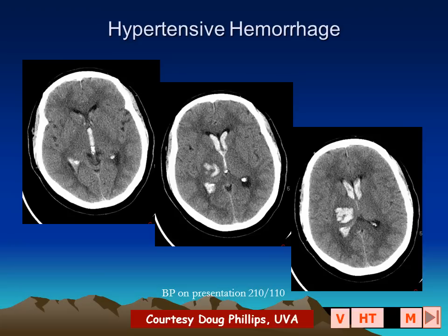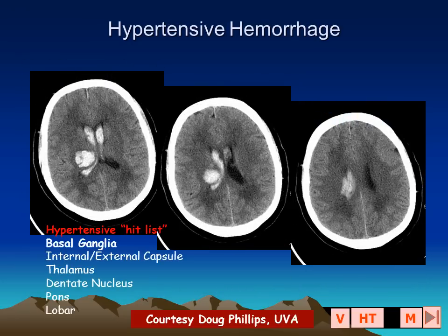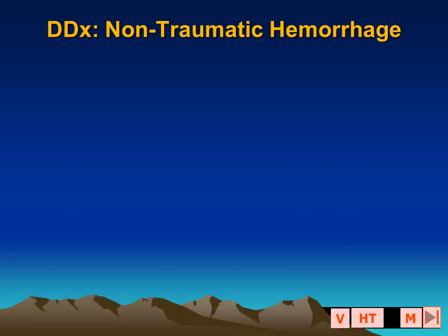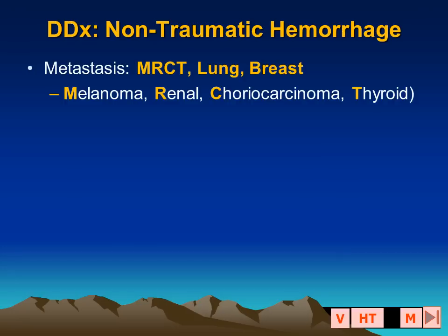When the hypertensive hemorrhage extends into the ventricle, the incidence of fever, seizures, and poor clinical outcome are much higher, as seen in this patient with a thalamic hemorrhage — this time on the right side — with clear extension of hemorrhage into both lateral ventricles.